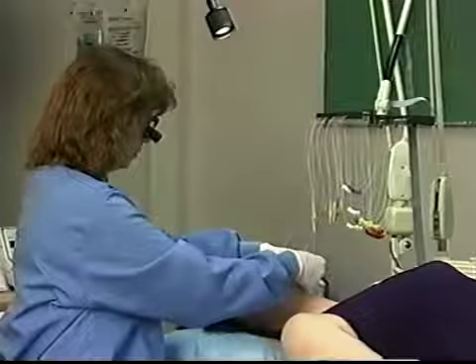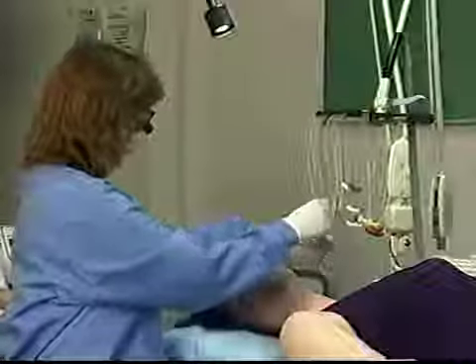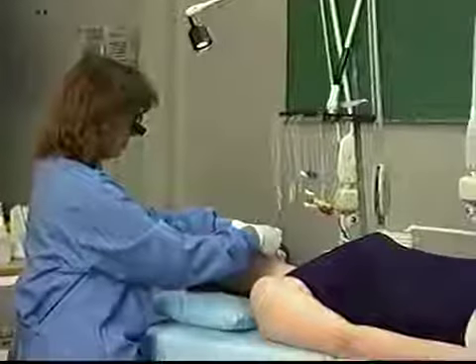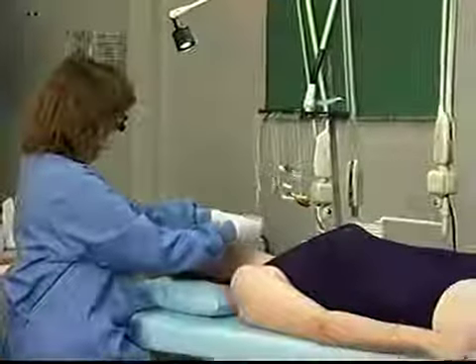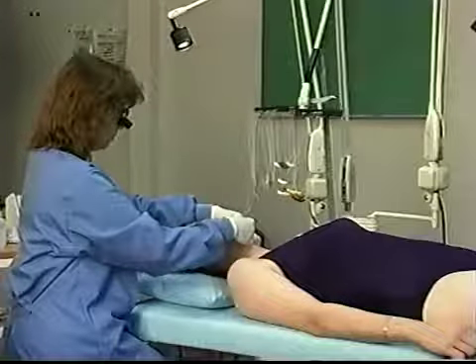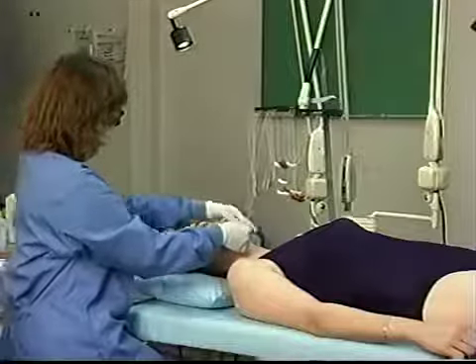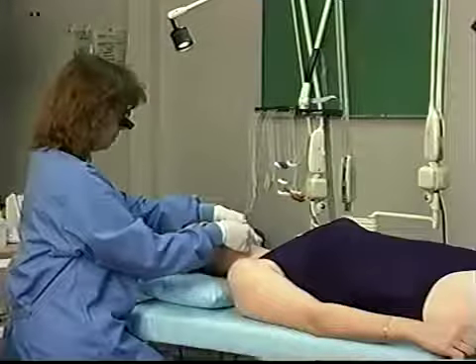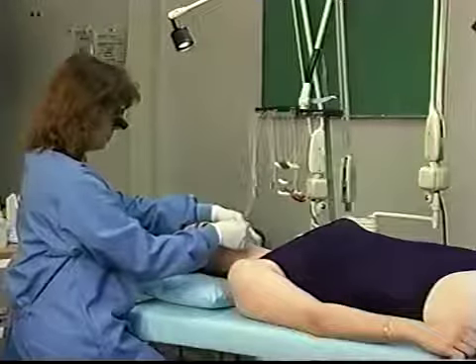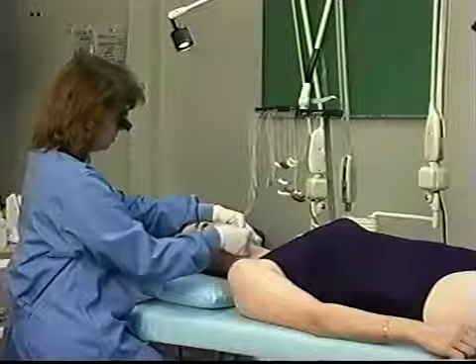Second, position the patient so the treatment site is flat and horizontal to accommodate gravity. It is difficult to work on a curved or perpendicular area. Third, the rack should be positioned so it does not get in your way. Otherwise, it may hamper your treatment. And fourth, you need to align the needles in the skin in an orderly manner and spaced so that they are easy to manipulate. Keeping those 4 rules in mind, let's consider the following positions.